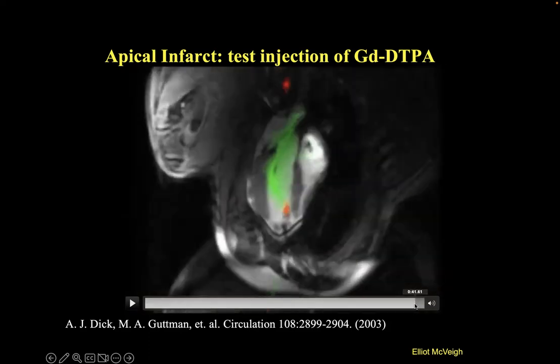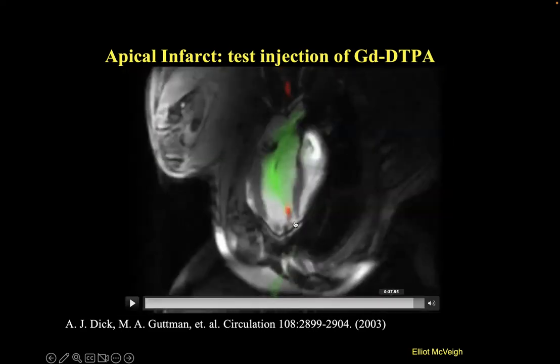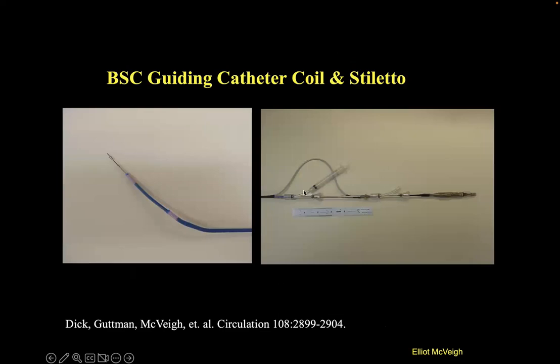We start in this condition where we have basically a bright spot where the gadolinium DTPA is. Then we go back, take this out, and replace it with the stem cells. The stem cells themselves were grown in a medium that contained ferromagnetic particles, so the cells ingested these particles and are now ferromagnetic.